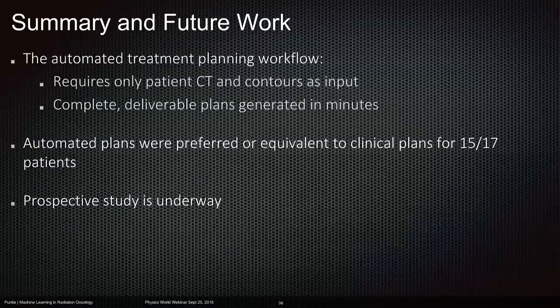From our retrospective study, we know that automated plans were better or equivalent to clinical in 15 of 17 patients we did, and our prospective study is underway.